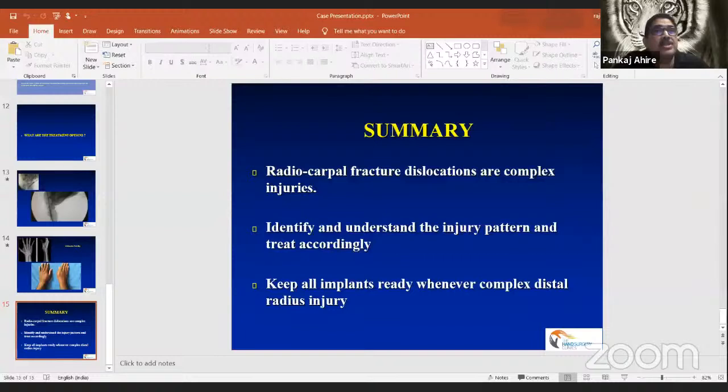Me and Damodare are doing a lot of external fixators for distal radius. In fact, our indications are fractures with intra-articular extensions, several volar Bartons with fracture of the dorsal cortex, even far distal radius, and distal radius extra-articular but unstable metaphyseal bursting. For all these, we are using external fixator. We have more than 200 cases by now, giving us good results.